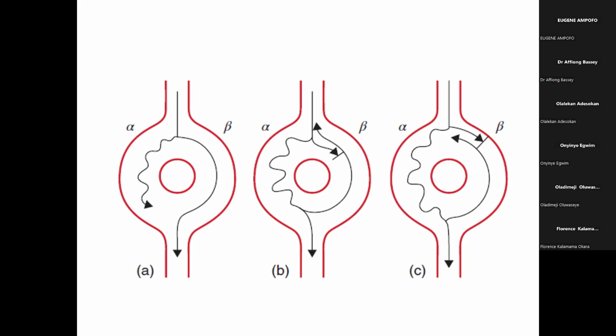Okay, so that's what I need us to understand between the two. The moment you have that understanding, every other thing is very, very easy. Does anybody have any question? Because this is very important in differentiating AVRT from AVNRT and things like that. Sometimes when you're looking at your ECG, you can determine the RP interval and state if it is AVNRT or AVRT, following the RP interval.